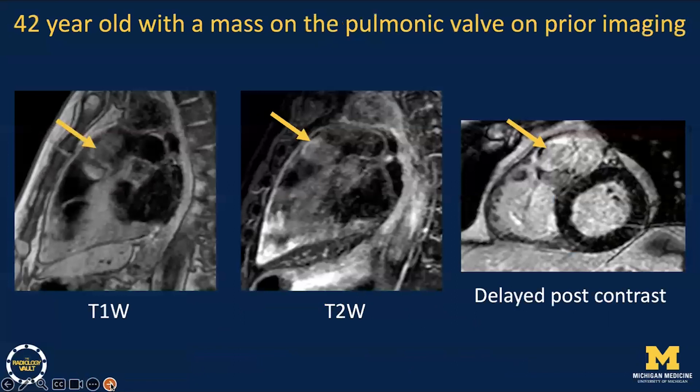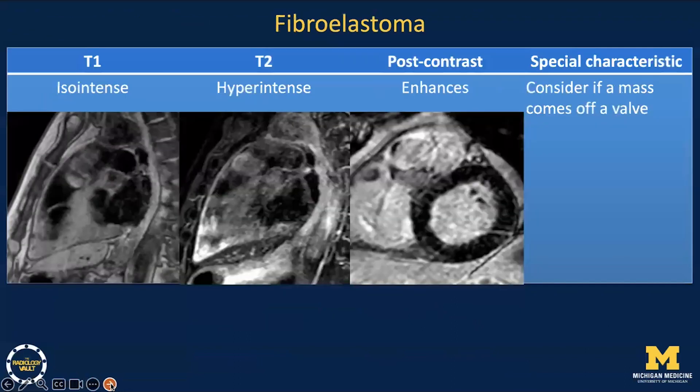This is a 42-year-old found to have a mass on the pulmonic valve. Fibroelastomas are a primary consideration for a mass that arises on a valve. These are typically small in size, and reported imaging findings on MR include T1 isointensity, T2 hyperintensity, and enhancement post-contrast. Again, location is key to considering this diagnosis.